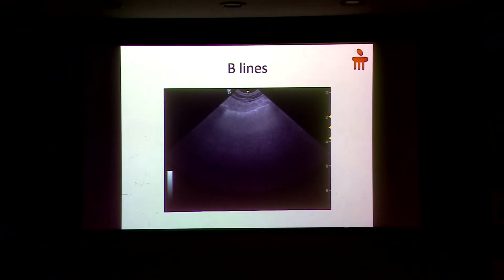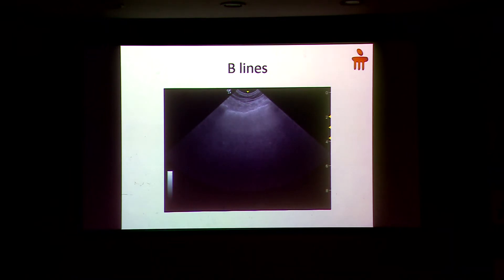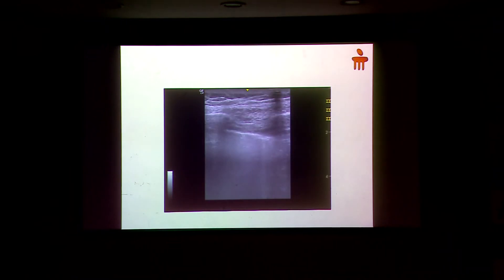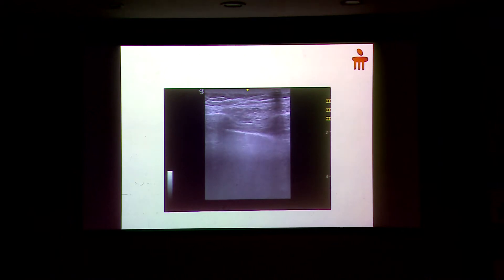In the picture shown before, you can see one or two B-lines. Here you can see there are more B-lines, because this patient has got more pulmonary edema.